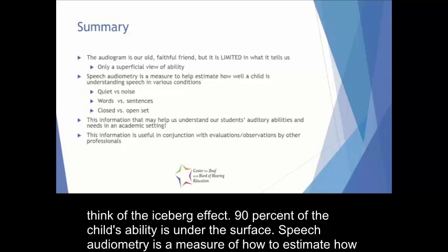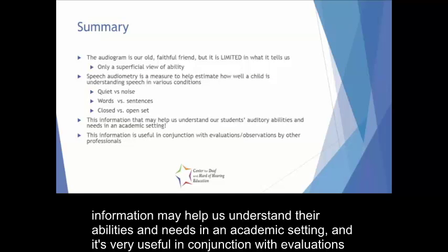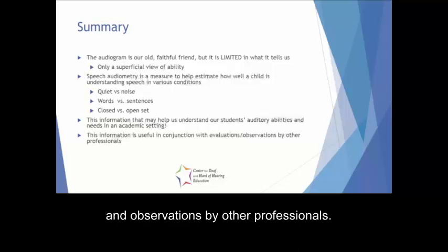Speech audiometry is a measure to estimate how well a child is understanding speech in various conditions, such as quiet versus noise, words versus sentences, closed versus open set. This information may help us understand their abilities and needs in an academic setting, and it's very useful in conjunction with evaluations and observations by other professionals.